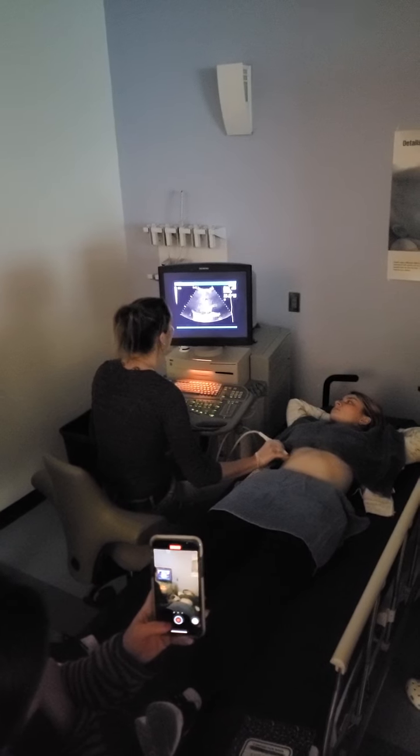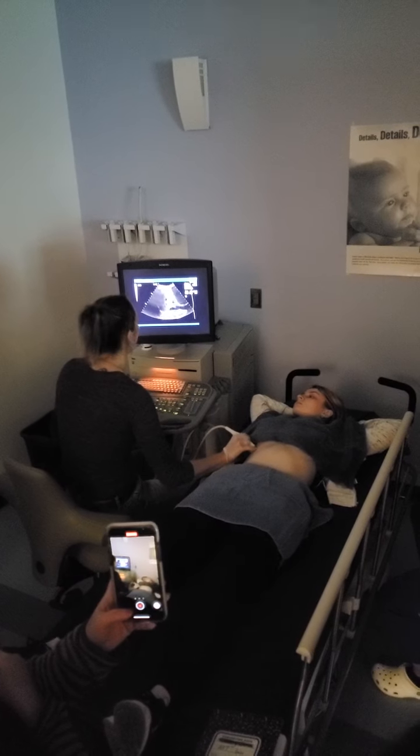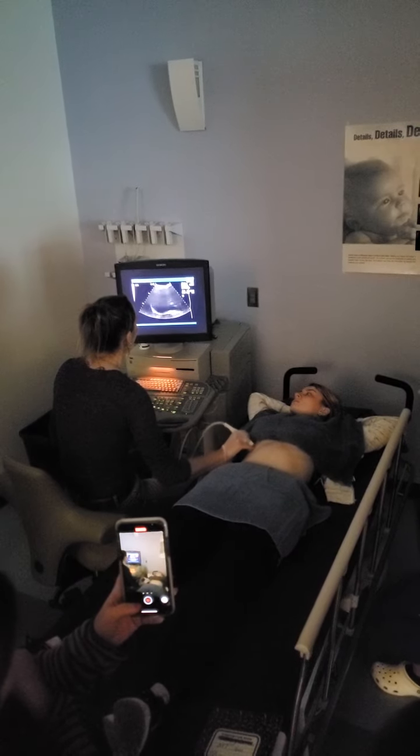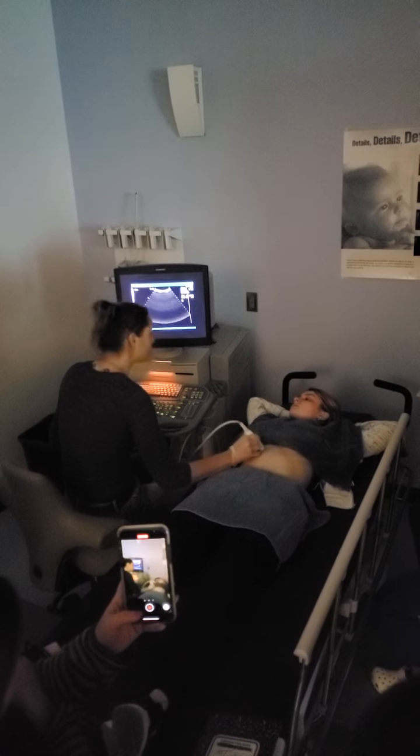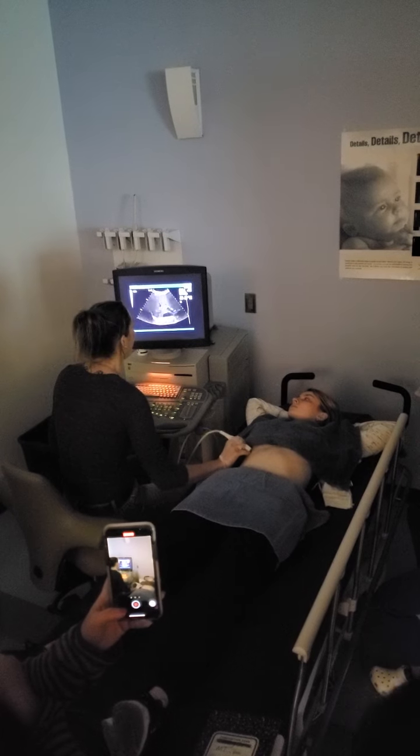So if I'm seeing kidney land, what do I need to do with my probe? Where do I need to go? Superior. So I'm just going to angle up superior. Oftentimes, students want to end up over here for intercostal, but it doesn't work as well. You have to be on this lateral aspect.